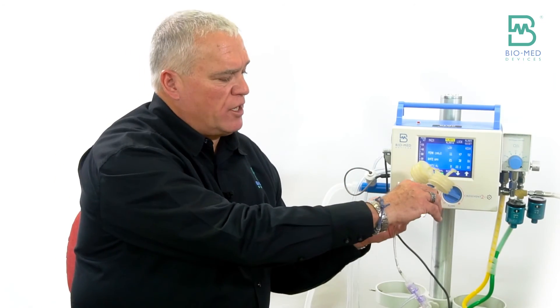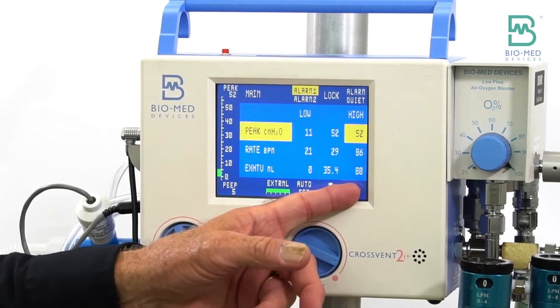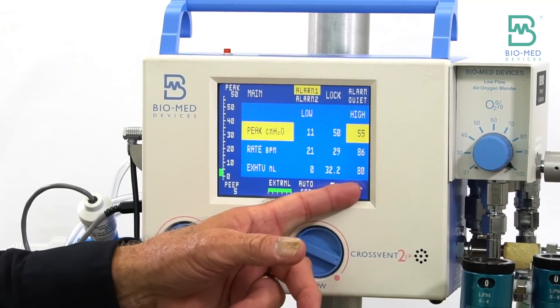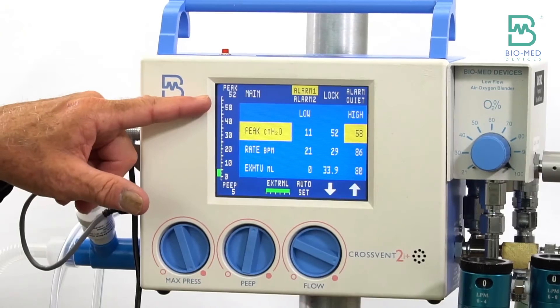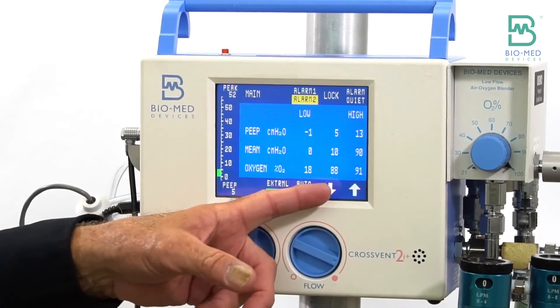First of all, now I'm hitting my high pressure alarm. It's taking 52 centimeters of pressure. Now look at my volume - I'm at 33-34 instead of 20.